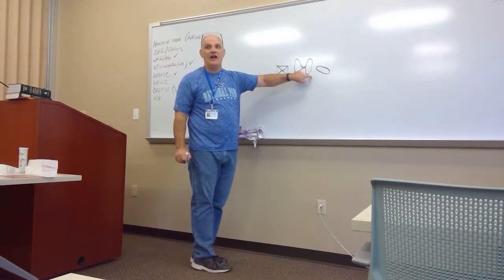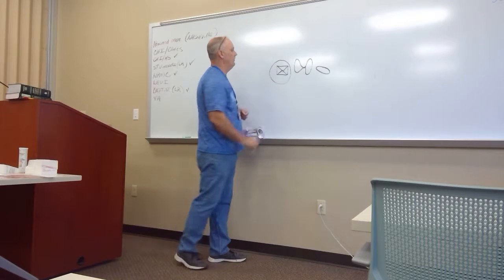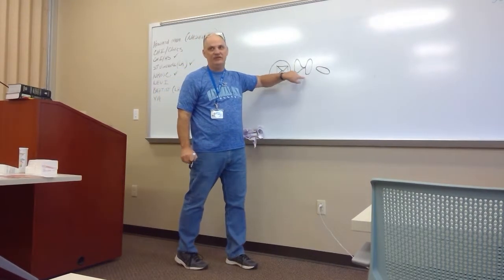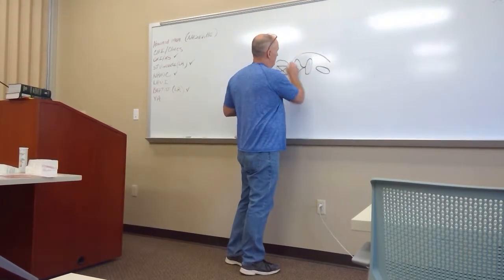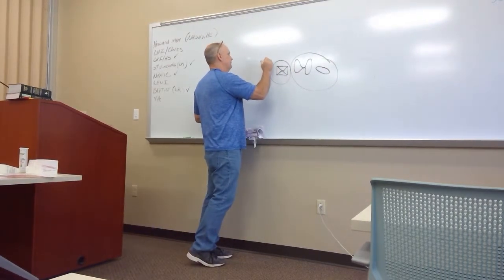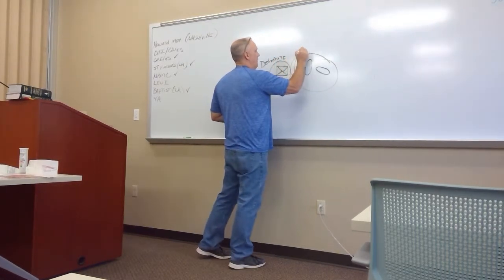This is the monohydrate form of calcium oxalate. Out of 100 times, you'll see the dihydrate 95% of the time, maybe the monohydrate 5% of the time. All right. Now, since we're on it, I'm gonna draw this dihydrate. This is monohydrate.